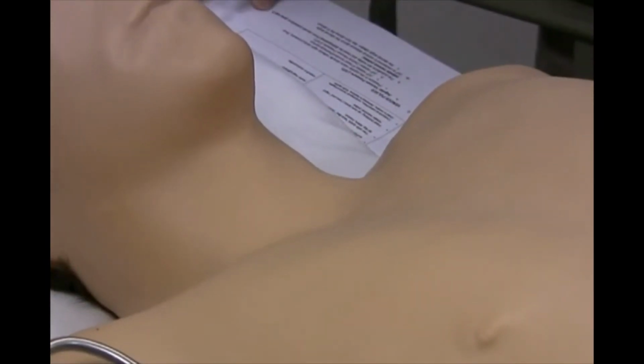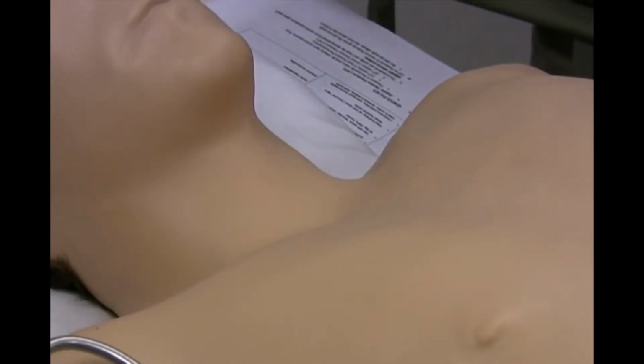We're going to talk now about the jugular venous pulses. As you can see on Harvey, he has some fairly pronounced jugular venous pulses. The jugular venous pulses will tell you about what's going on in the heart, particularly on the right side of the heart in the right atrium, because there is a direct connection between the right atrium and the jugular venous pulse with no valves in between.